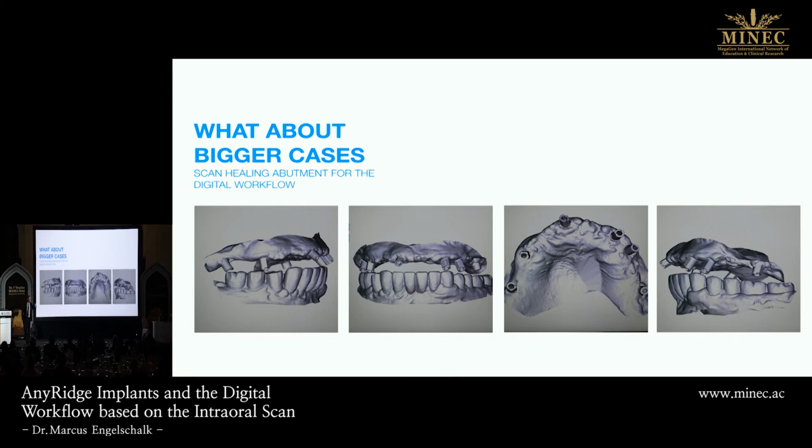This is the lecture we heard already, how far he can bite. So we have to prepare something in the lab to bring into the mouth to scan first the left and then the right side. Because there's no system at the moment on the market available to just say to the patient, just close your lips, relax, and I will scan something, bring something on your head, and the bite is correct. No. You have to do it in a combination of the traditional way and the future.